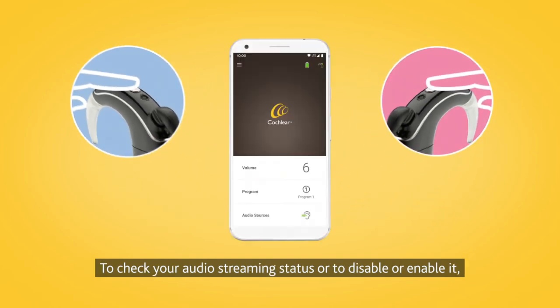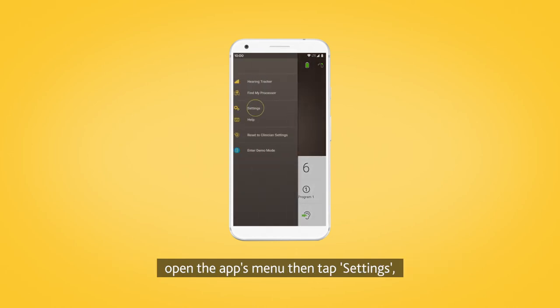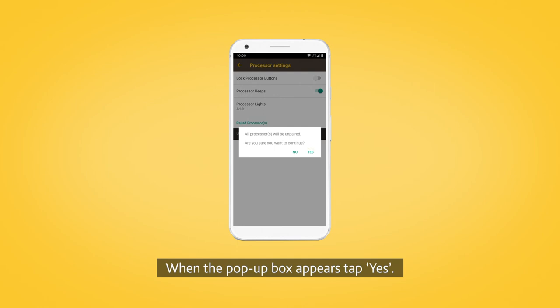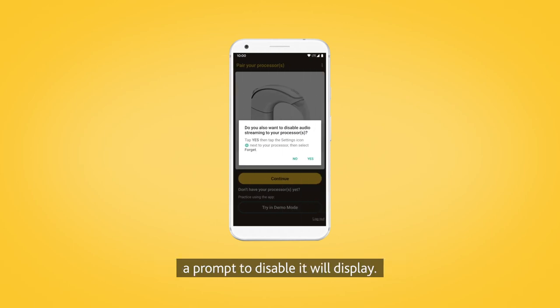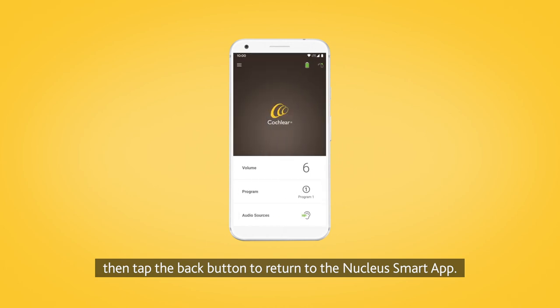To check your audio streaming status, or to disable or enable it, open the app's menu, then tap Settings, Processor Settings, and unpair your processors. When the pop-up box appears, tap Yes. If streaming is enabled for your processors, a prompt to disable it will display. Tap Yes, and follow the prompts to forget your processors. Then tap the back button to return to the Nucleus Smart App.